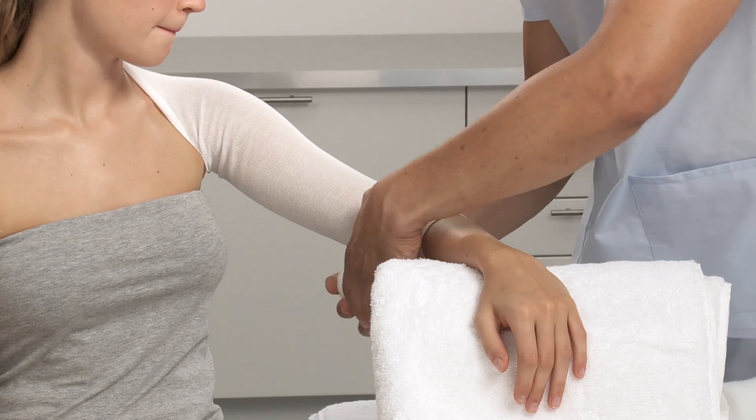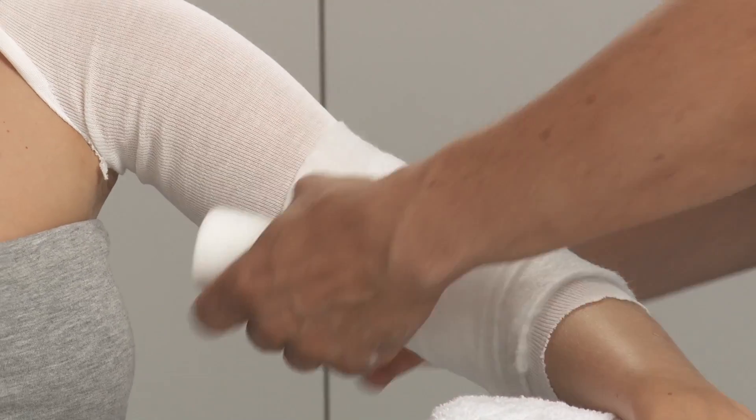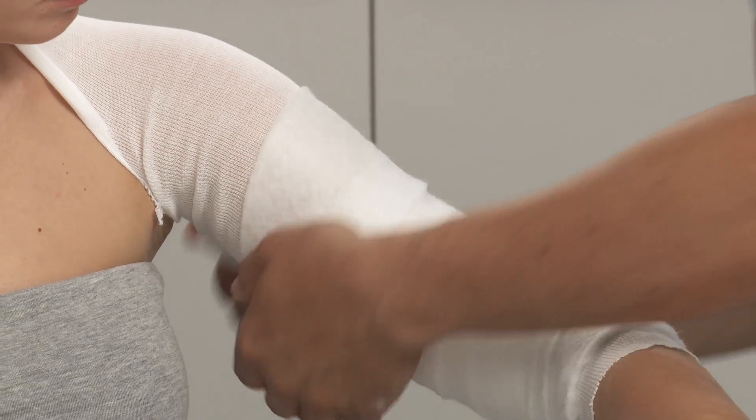Apply padding to the limb by wrapping it from below the elbow up to the shoulder. Use extra padding for any bony prominences.